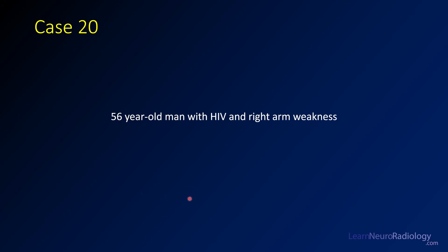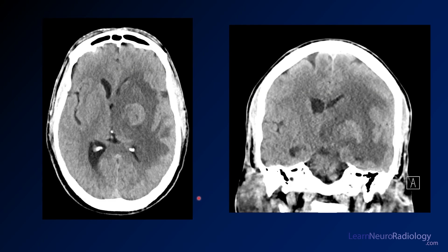Today's case is a 56-year-old man who's got HIV and right arm weakness. Hopefully these images are going to give us a little idea about why he's got arm weakness. I've got a couple images from a CT of the head, non-contrast — axial and coronal. Hopefully by now you're finding abnormalities pretty easily.